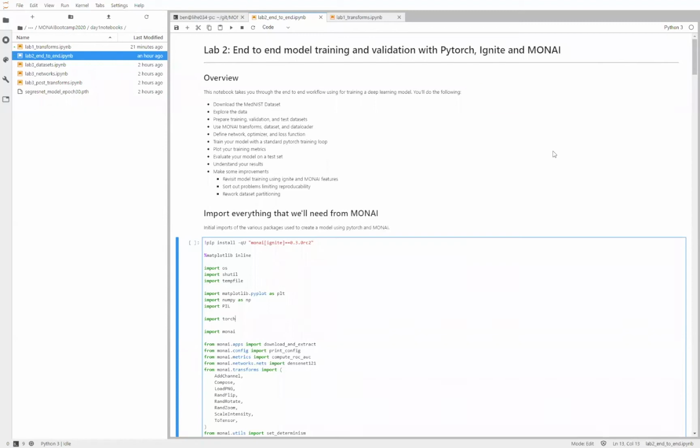So we'll ask you to take a look at the way you can sort that out. Part of it is through making use of some of the nice features of the MONAI transforms, and some of it is going through cells and making sure you create your own random state instances. That's all I have to say for now.